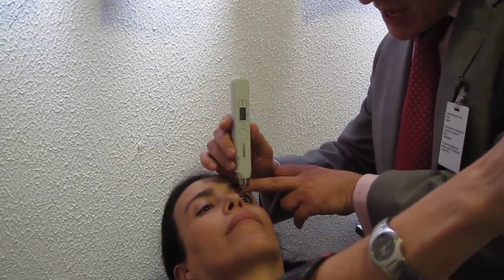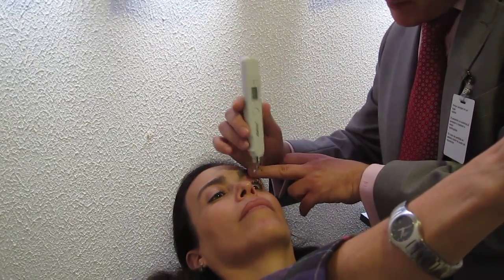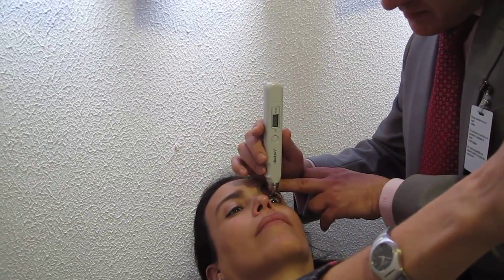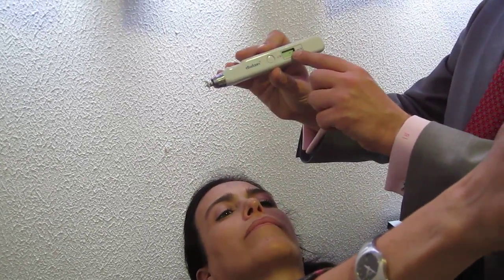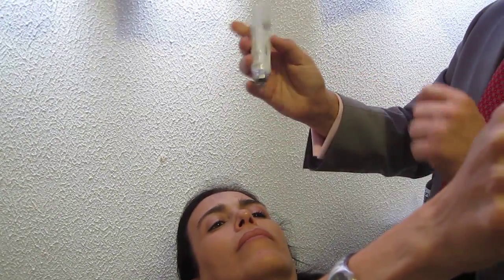Gently pull on the eyelid to make sure the edge of the lid is above the edge of the limbus. One, two, three. The device gives you a long beep — minus three is the number of readings. Press the center button and you get the average of the readings.